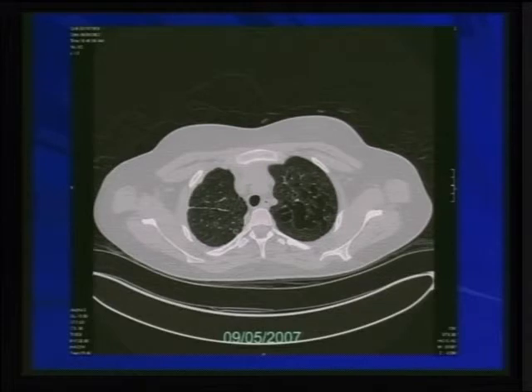The other one is this entity. Can somebody tell me what this entity is? Histiocytosis X. Right? So the thing that why we recognize this is not only because they have a definable wall, but it has this bizarre shape and they're not uniform size cysts. And so this is also in patients that are heavy smokers, but it is also a separate and easily diagnosed condition.